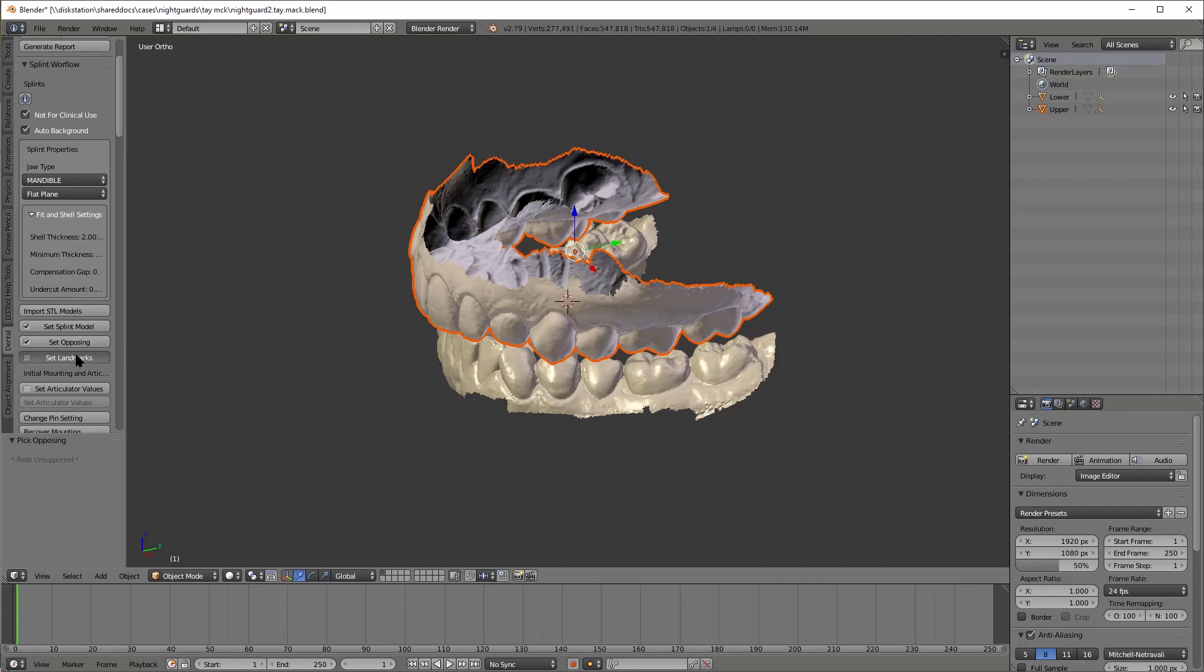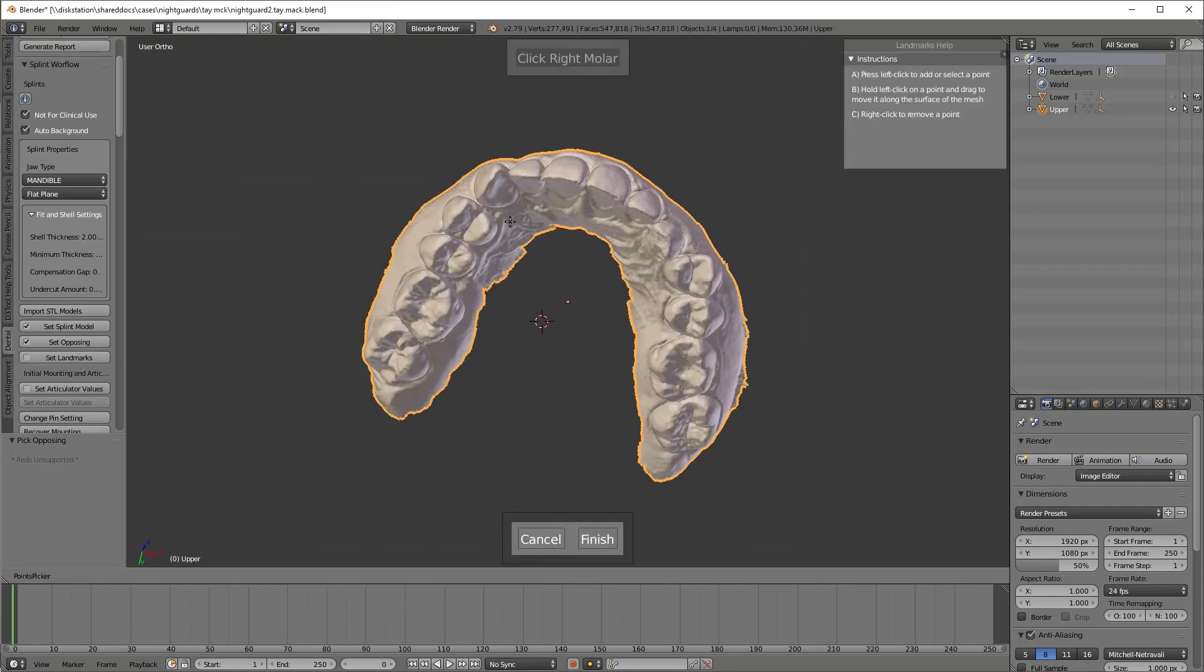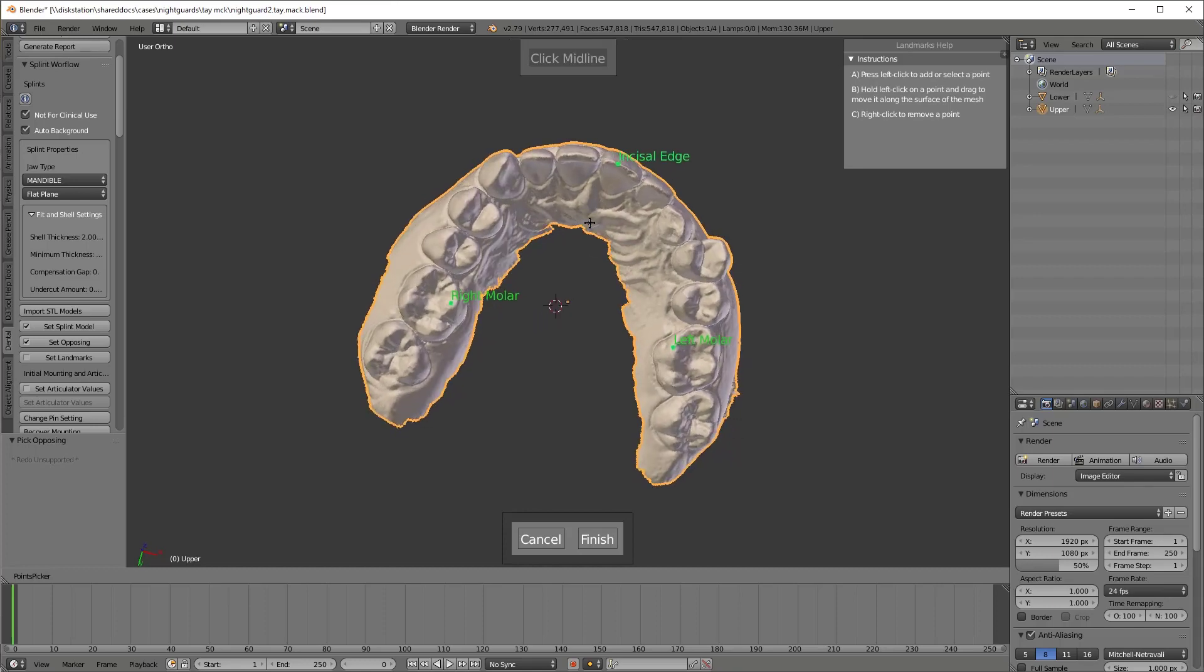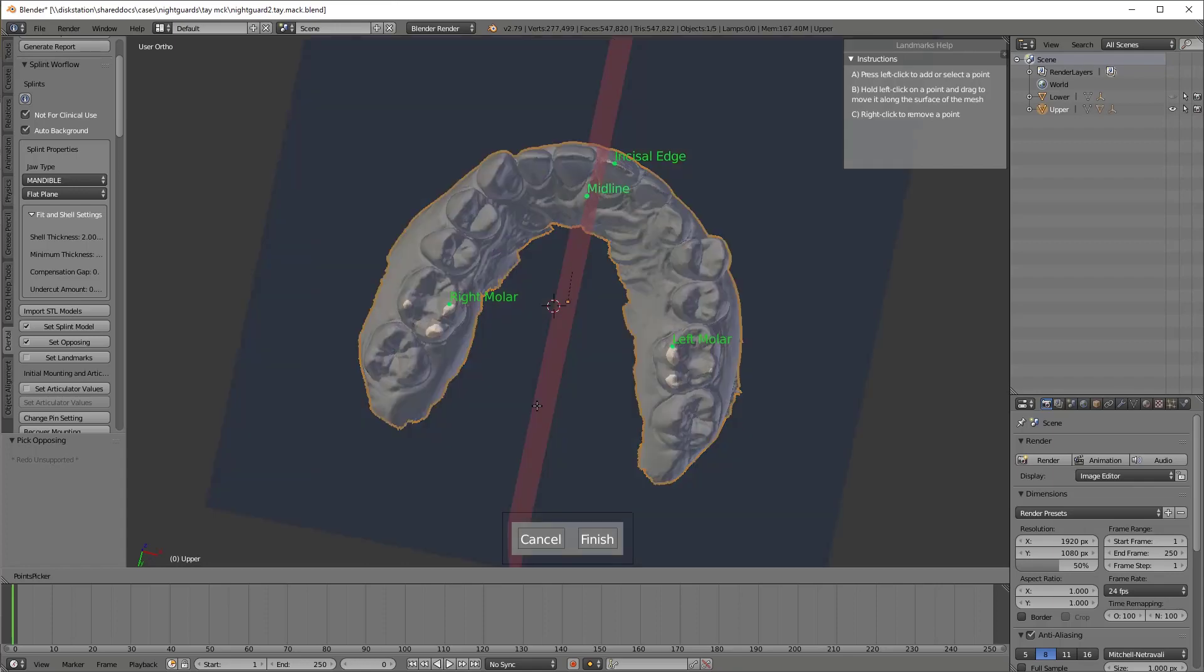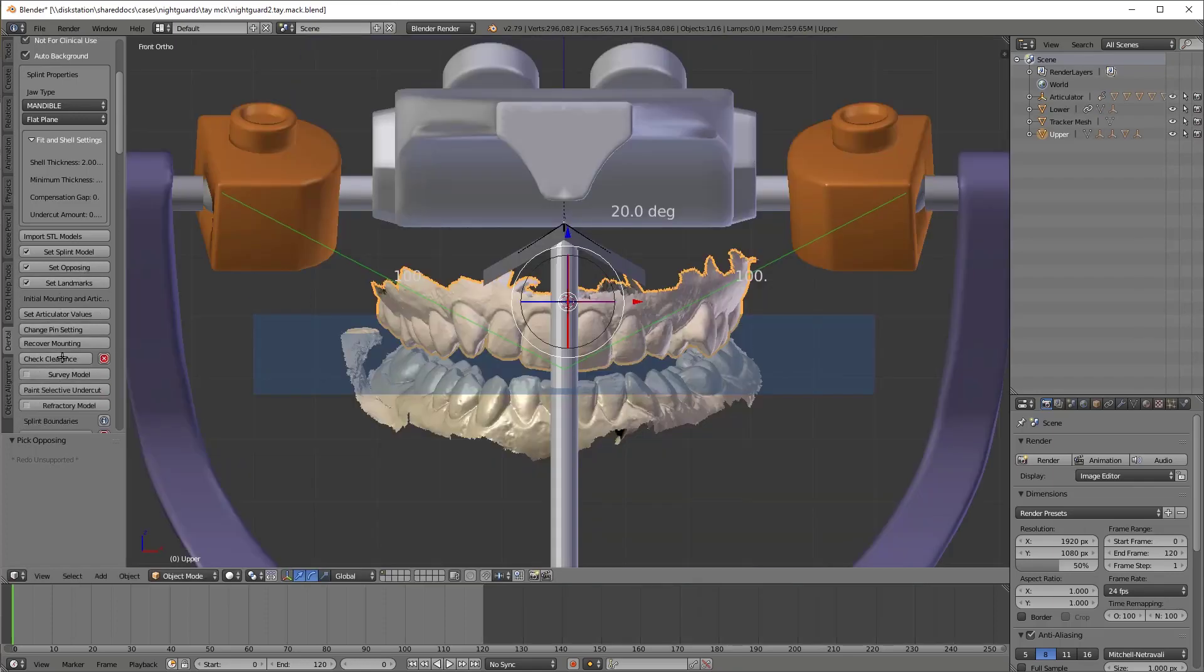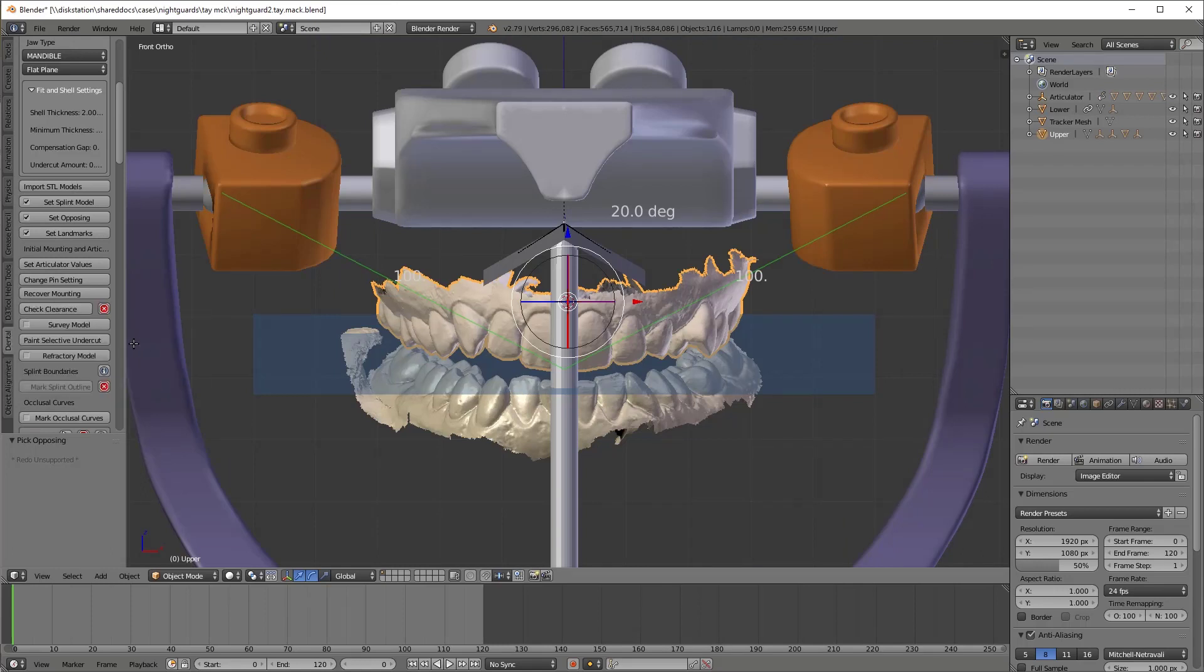After that we do our landmarks, right, left, incisal, and midline. That's to determine our occlusal plane. Also to set up the virtual articulator. This works very similar in principle to how the Kois facebows work these days.